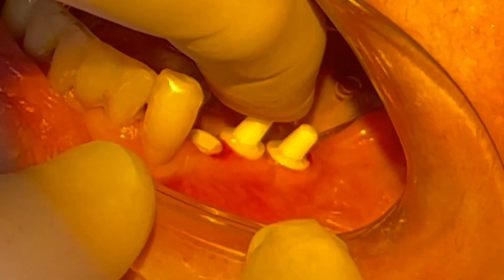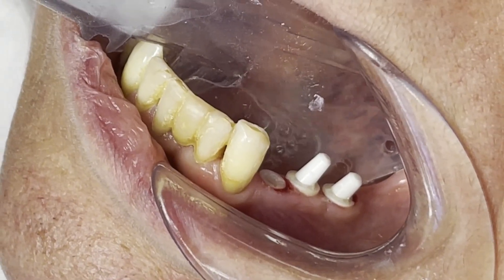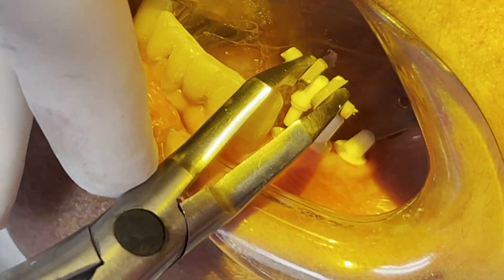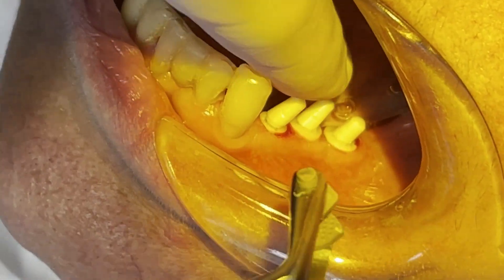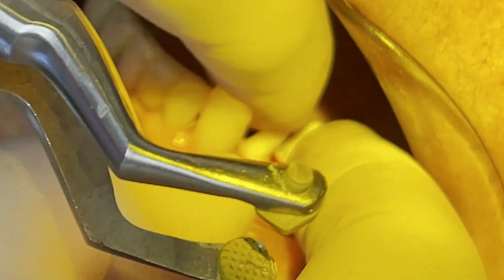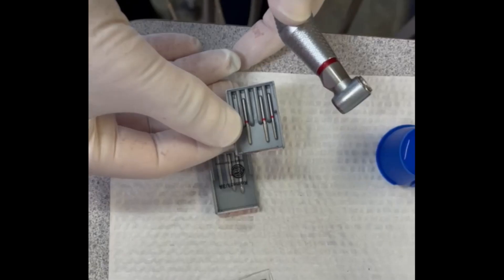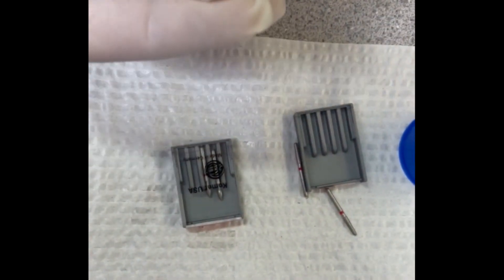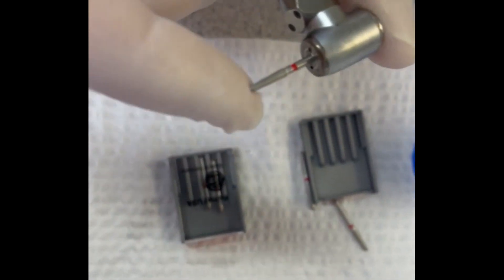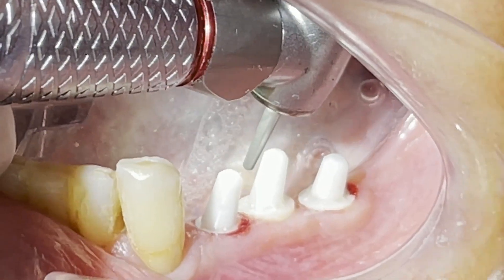For all three implants I chose angled abutments with them all facing labially, to be closer to the opposing dentition — which is really a full denture — but it also creates a little more room for the tongue. These abutments are preppable, which means we can prep them just like teeth, as long as we use our brand new red stripe fine diamond burrs.